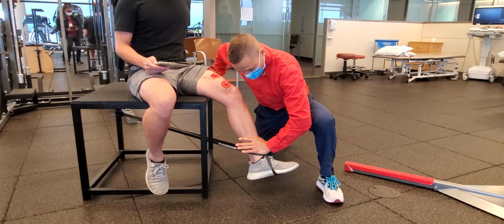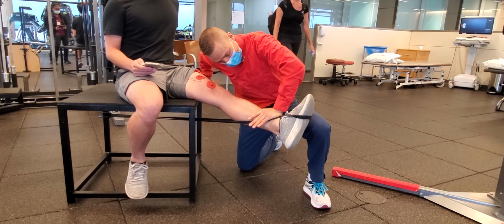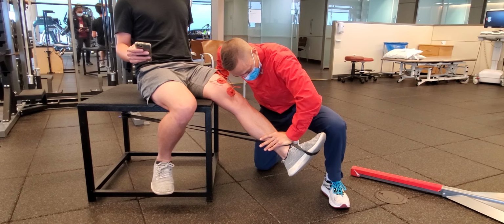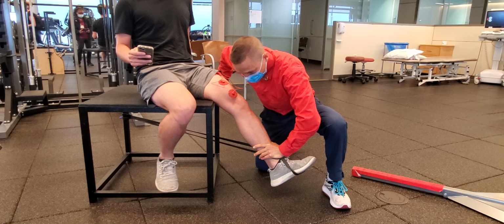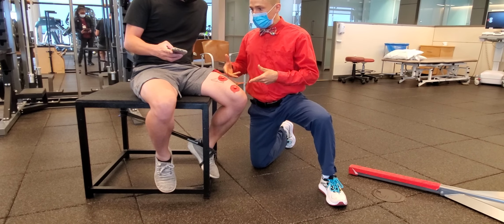And then push, push, push, all the way up, all the way up. Get there. And hold, hold, hold, and done. Great. So you would go through your three sets of 10.